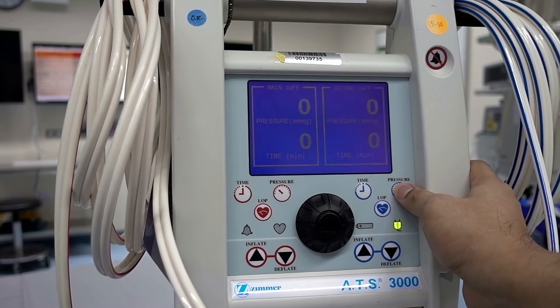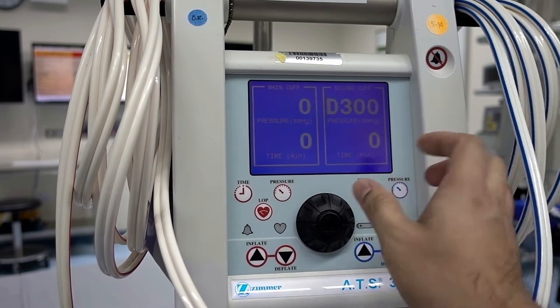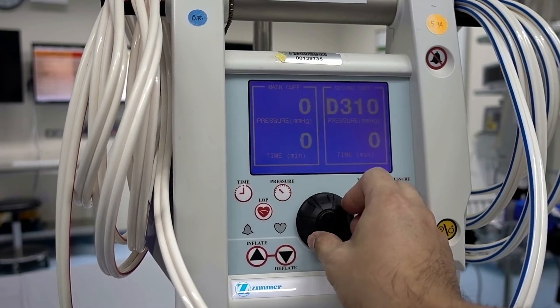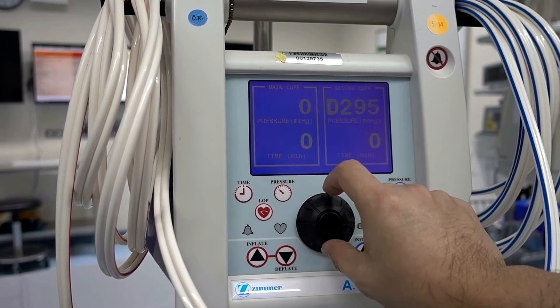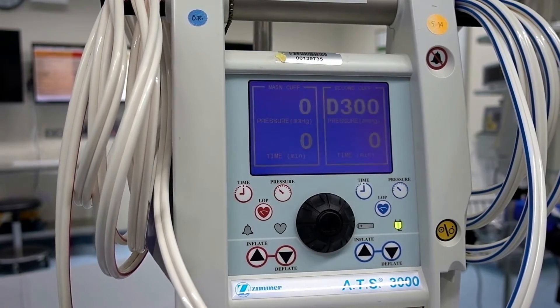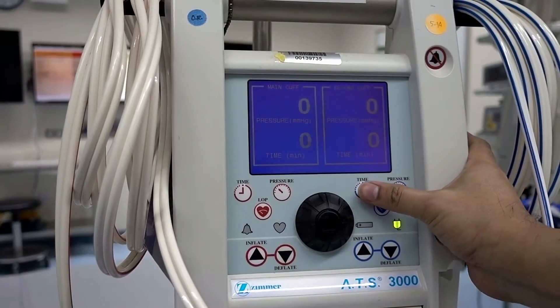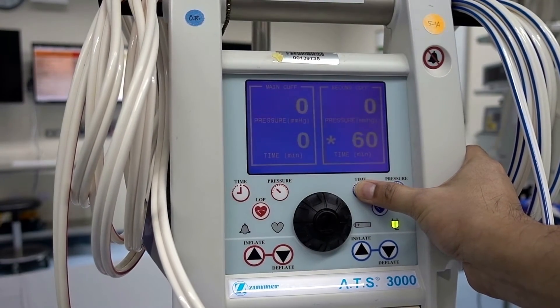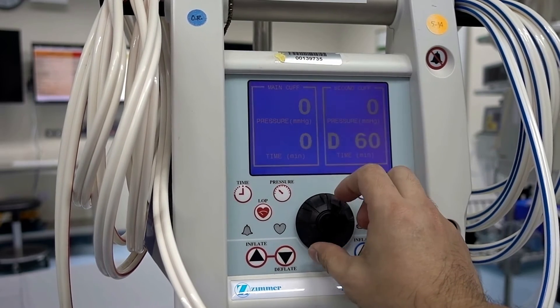Pressing and holding the pressure button for more than two seconds allows you to verify and change the default pressure on the display. To check and change the default time on the display, do the same step that you did for the default pressure.